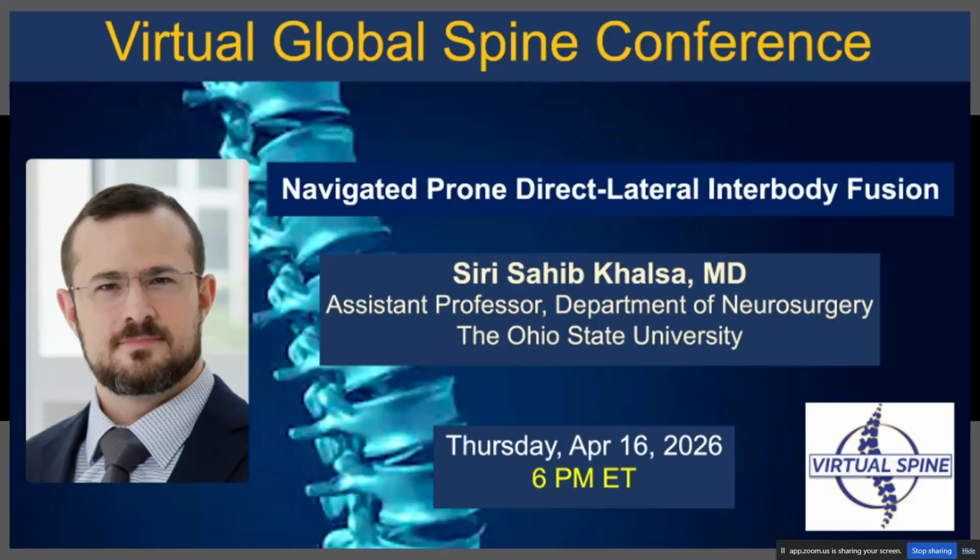And I know it's not for everyone, but when you do a corpectomy in, say, a semi-urgent situation where you can't really treat osteoporosis, you can load the vertebral bodies with cement through the pedicle screws. And so then when you expand a cage into that, you've got the support in the cancellous bone already. That makes sense. Which can be very helpful.